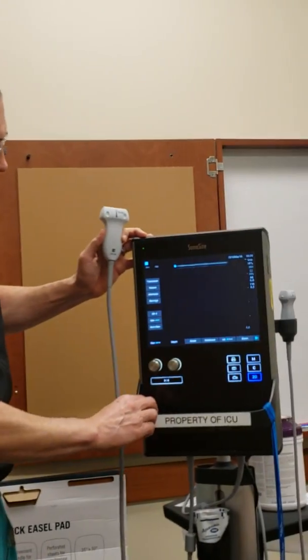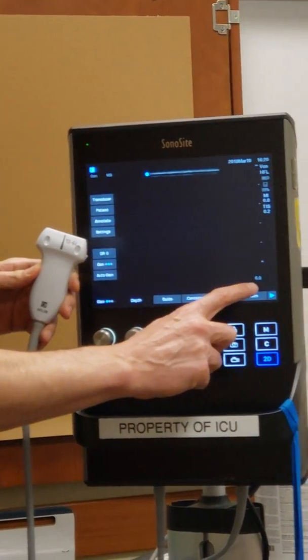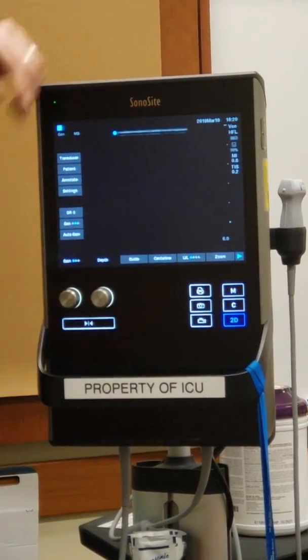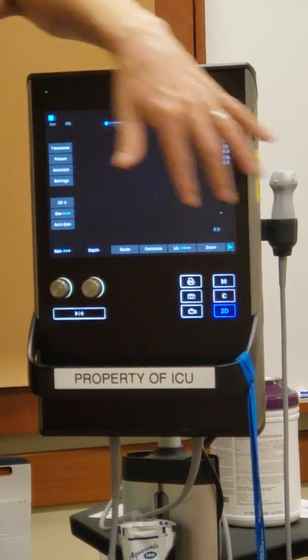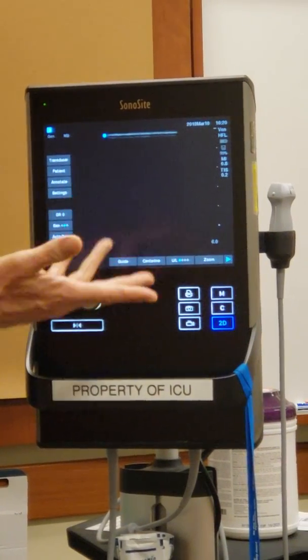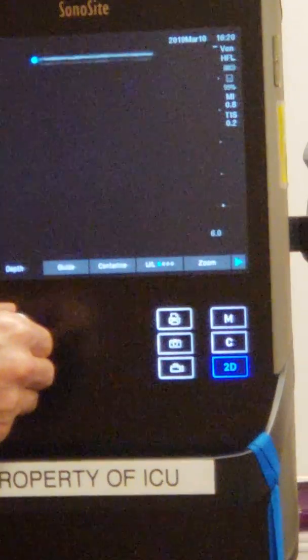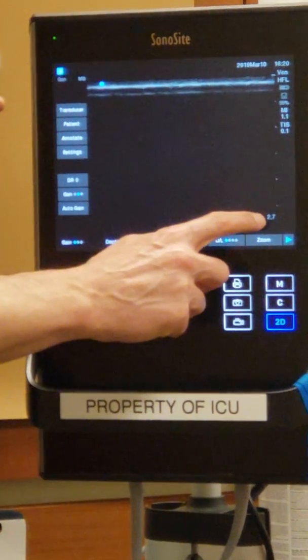One of the buttons I want you to know is depth. When I turn the depth, the maximum this probe can go to is six centimeters. On the side here you have centimeters — each of these little notches is one centimeter: one, two, three, four, five, six. You'll commonly hear us say a structure is too deep, so turn it so the centimeters are less.